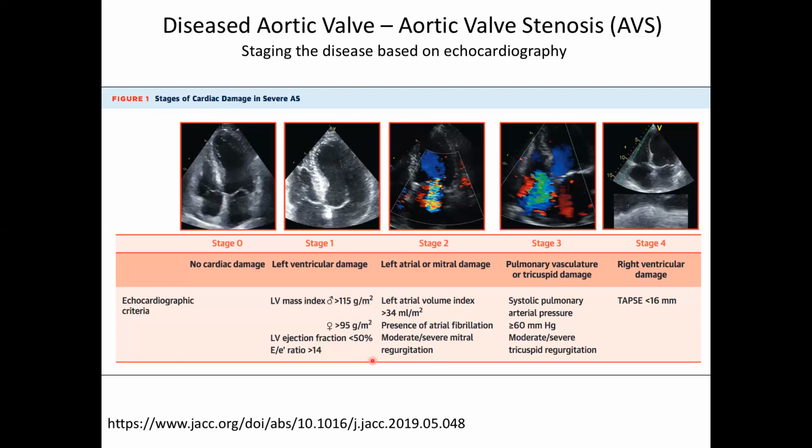A lot of them have a computer that drives velocities through tubes of different fluids and things like that. And some people do it for their PhD. They come up with the most fantastic phantom in the history of that imaging modality. So it's not uncommon in an engineering lab for somebody to do that.